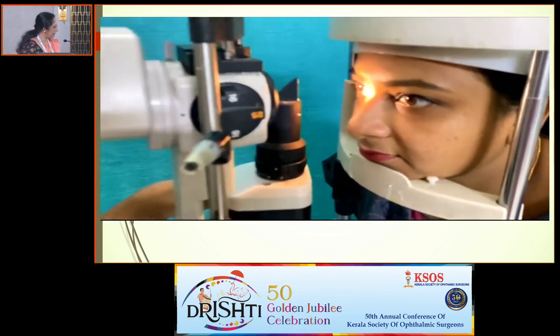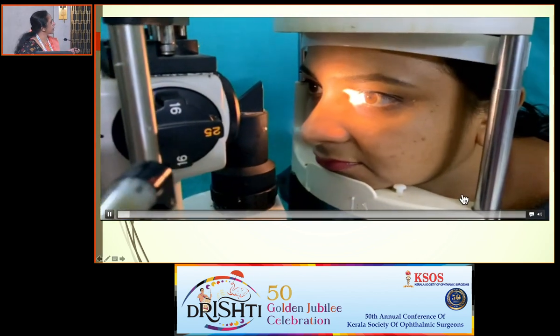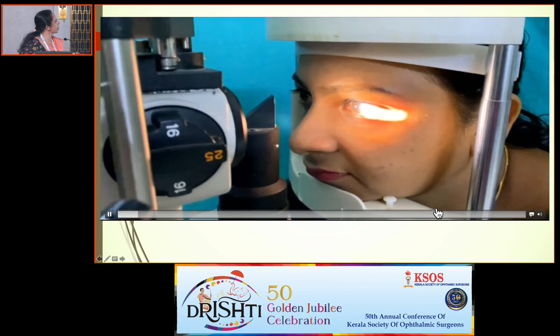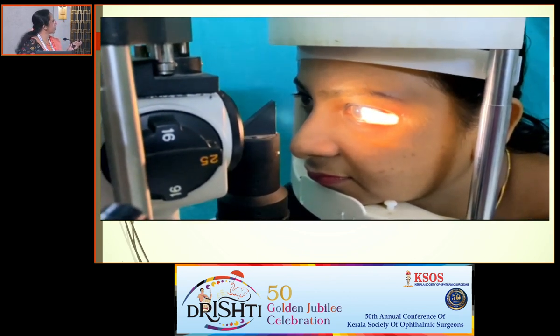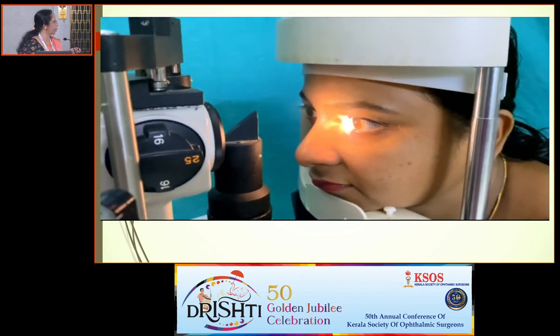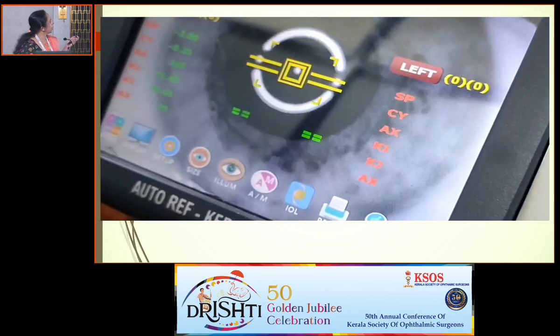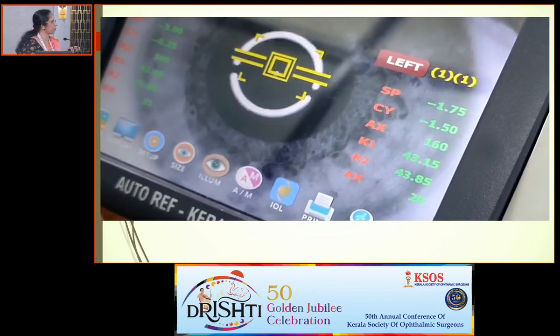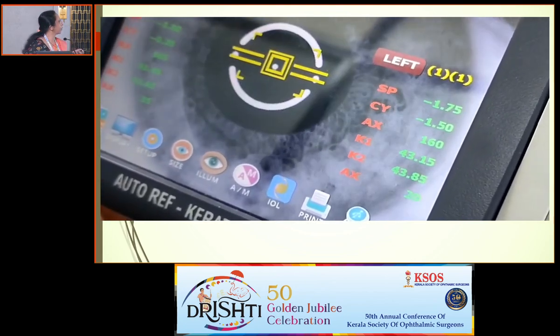On the slit lamp, the patient has to be scanned throughout for any abnormalities which may hinder contact lens use. You have to scan from the temporal to the medial side. See whether there is any evidence of lid abnormalities, and check the conjunctiva. Then a subjective and objective refraction has to be done for the patient.